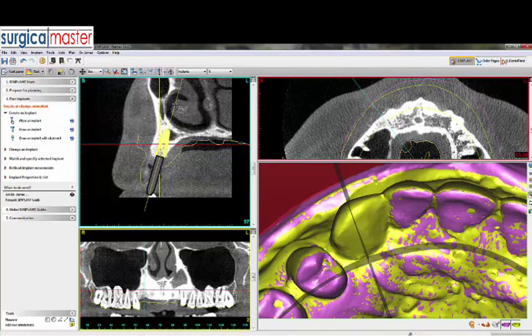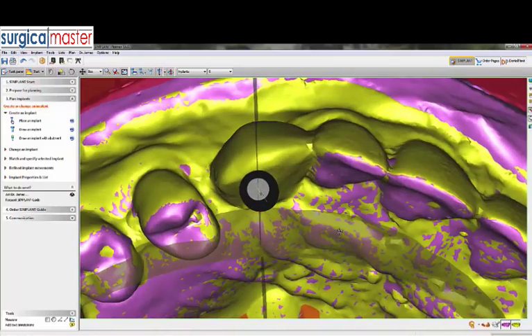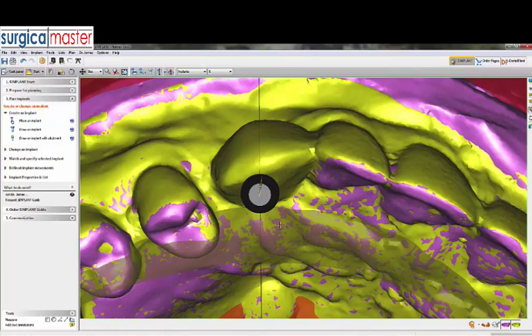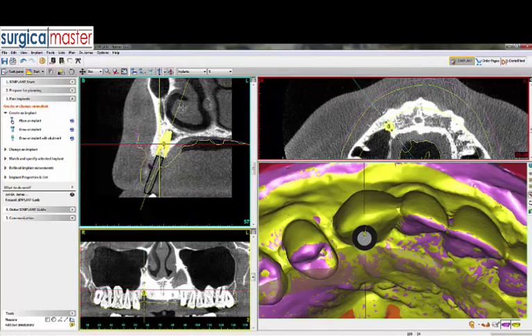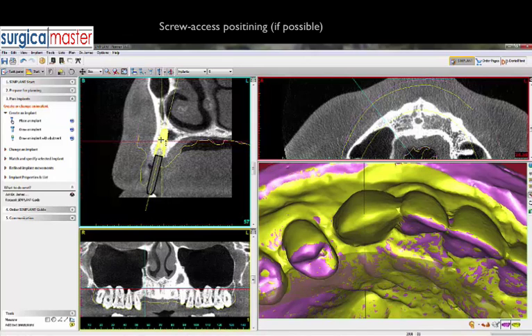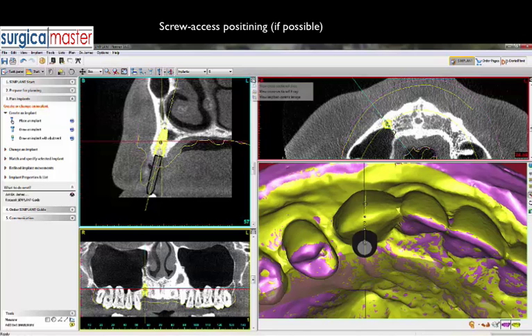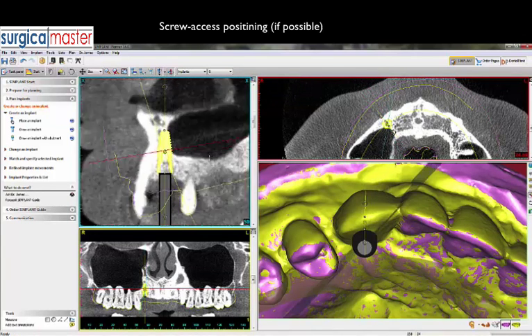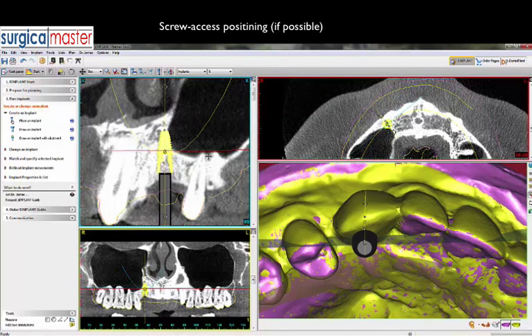This really helps me visualize the right prosthetic position. What I'm aiming for is a screw axis through the cingulum of the wax-up. We can see it's a little too much to the distal and too much to the buccal, so I'll make a change to account for the buccopalatal position through the cingulum. Looking at the implant in a centric view — meaning the implant is the center of the cross-section — I'll now look mesiodistally.